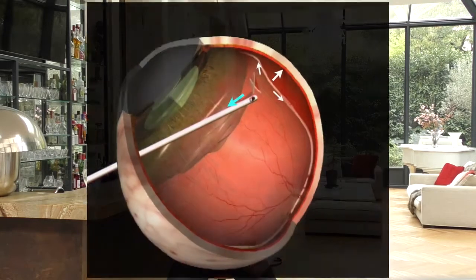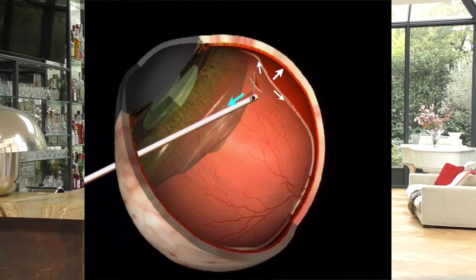This suction flow rate, which is just above the overall restoring force of the traction, can therefore only be assessed empirically on a case-by-case basis. You will need to increase the flow rate gradually to first create horizontal traction, then bring it into the port before cutting it at the desired location, just like cutting a suture wire flush with the knot.